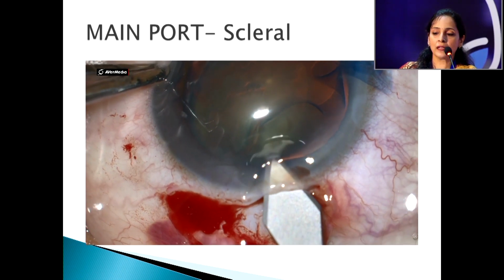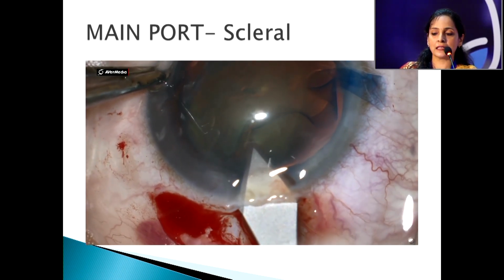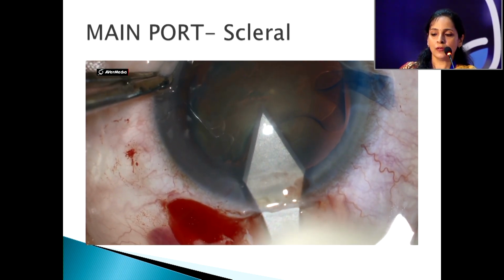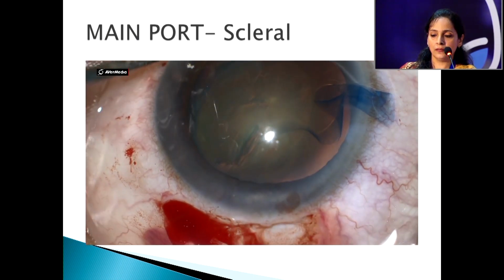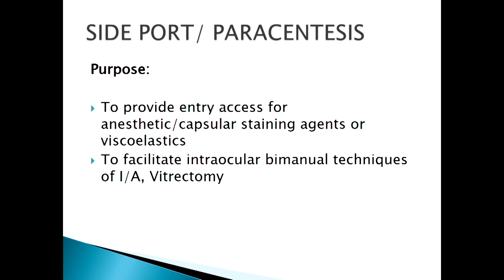So this is a beginner video. You can see there is a slight bit of hesitation entering the AC, but still the beginner surgeon has managed to create a good square-shaped incision. So let's move on to side port now.